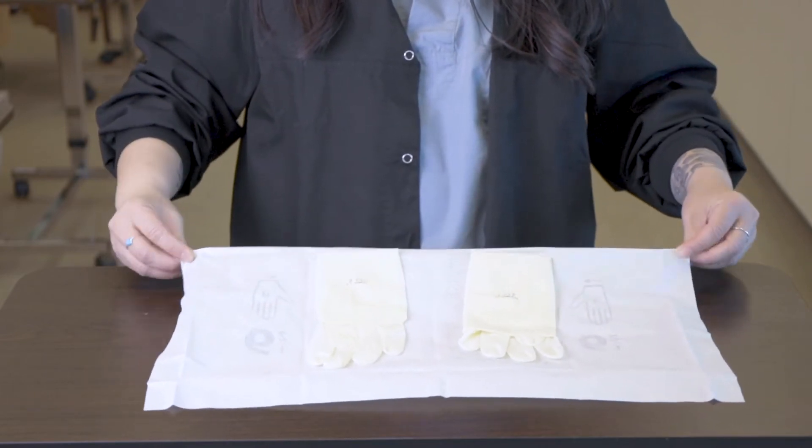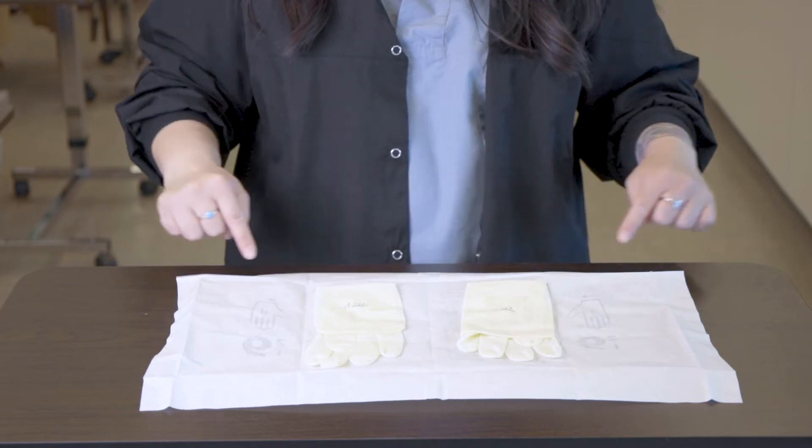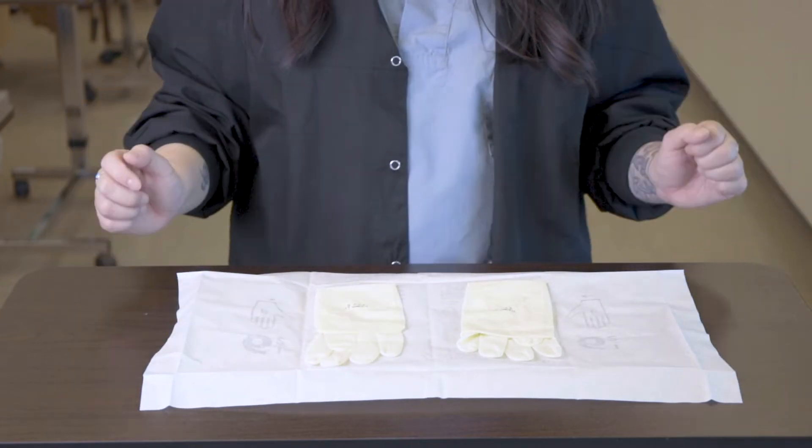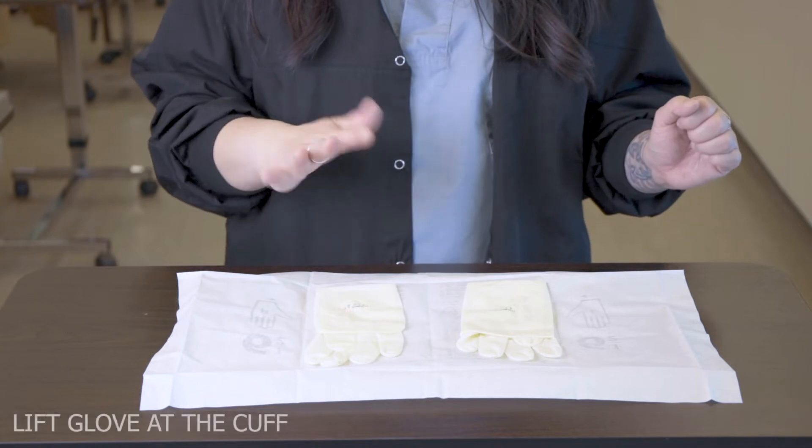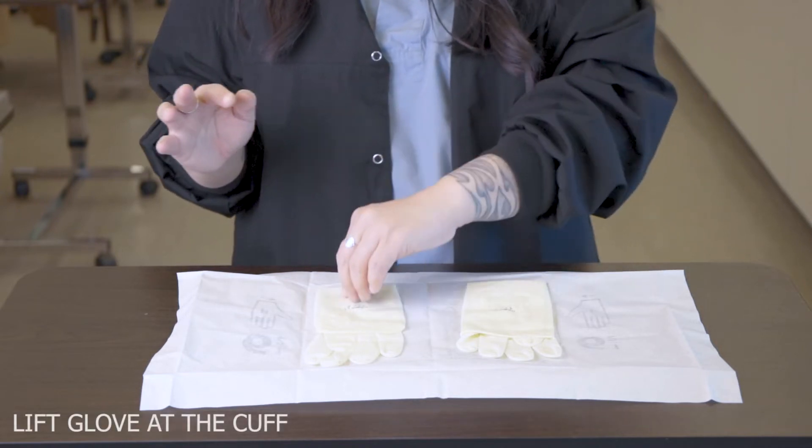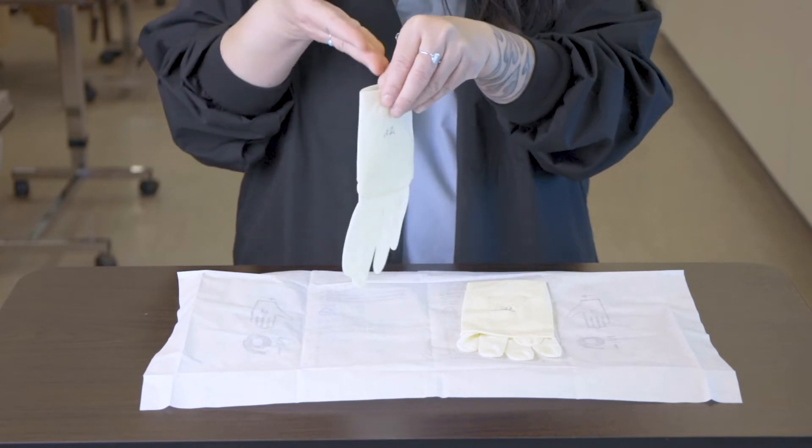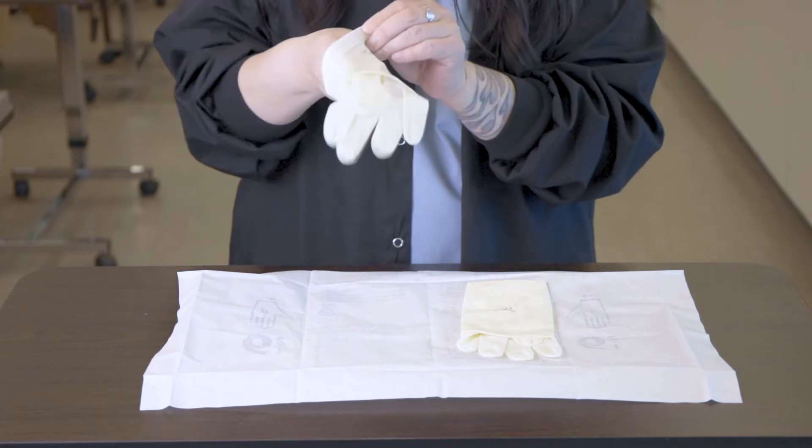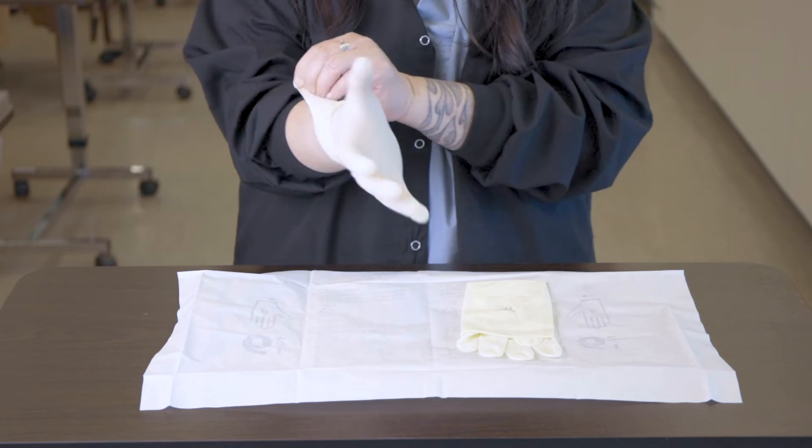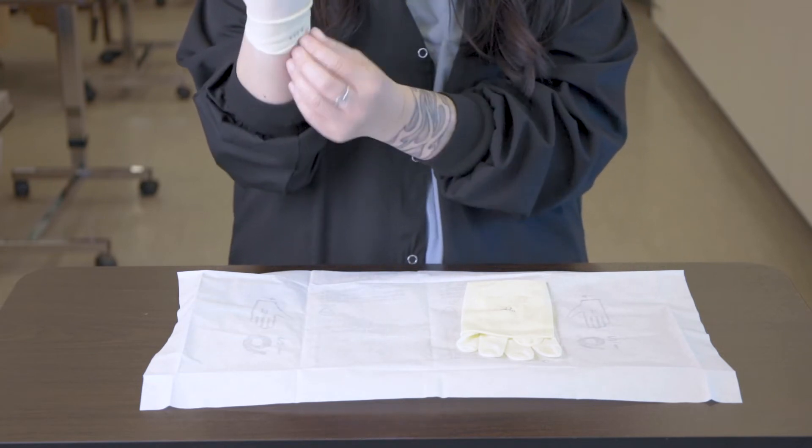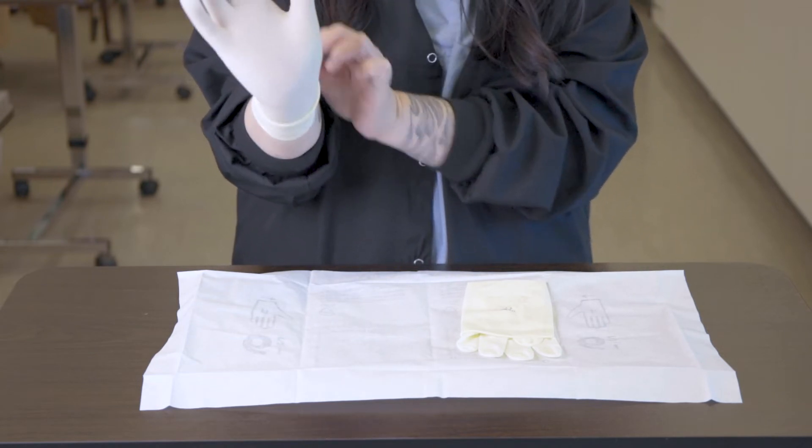I'm right-handed, so here I'm going to be picking up the right glove at the inner cuff with my left hand and donning the glove on my right hand. I am adjusting the inner portion of the cuff and not touching the outer portion.